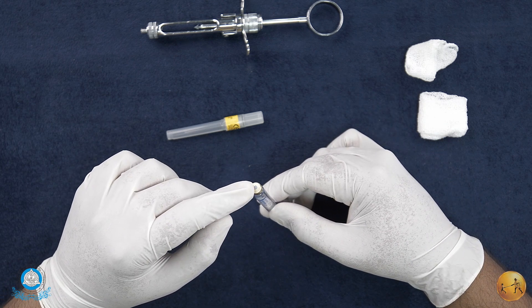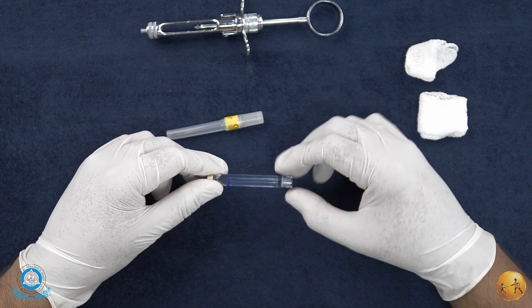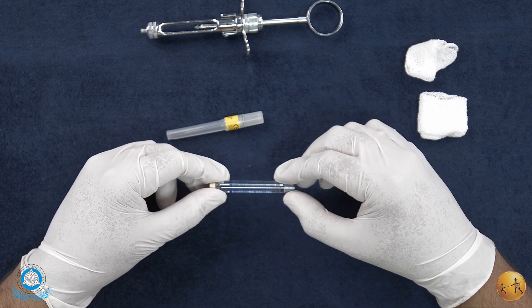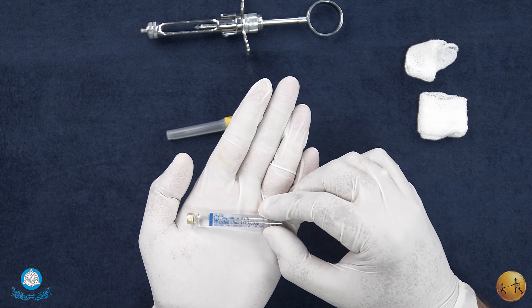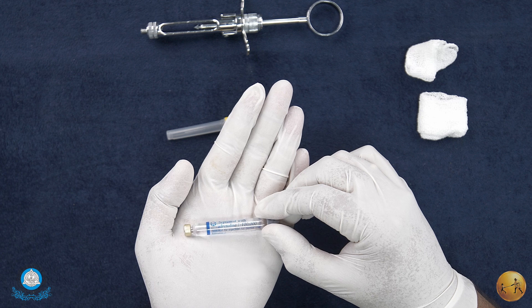That's the gray diaphragm that you see. Each cartridge is color coded for the particular drug that it has. You can see the blue color code here - this has articaine in it.